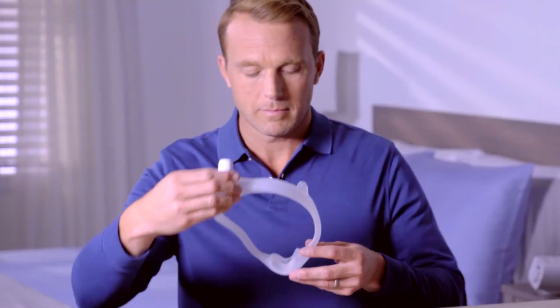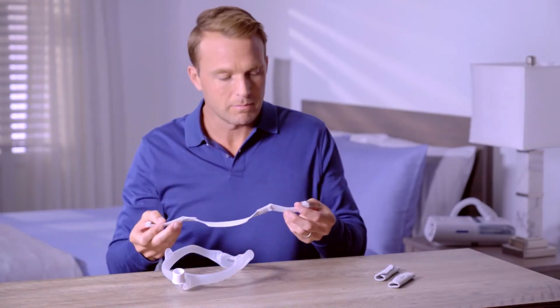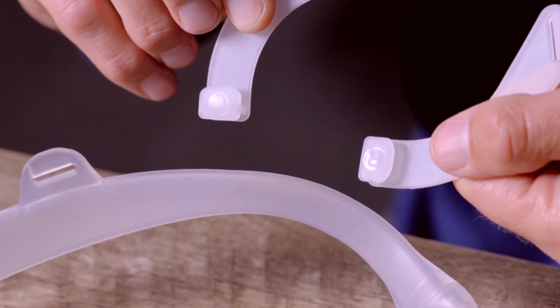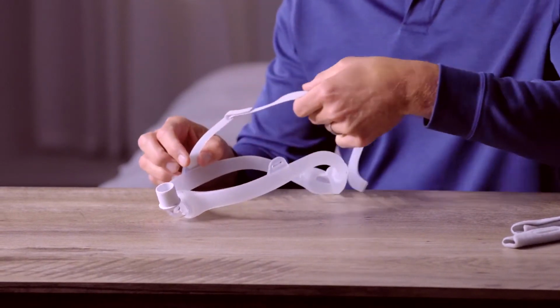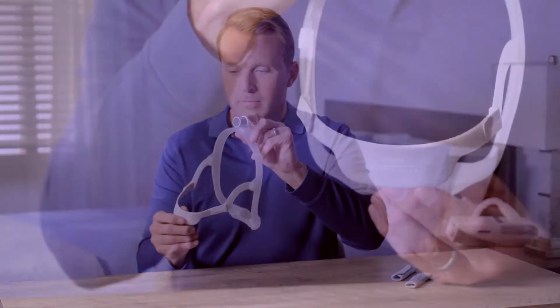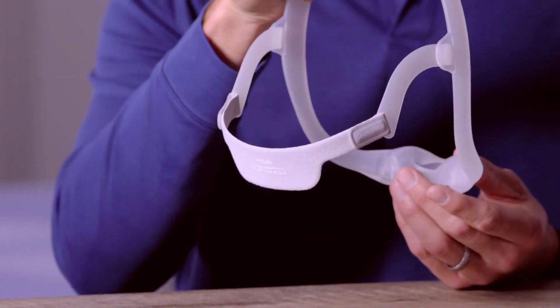To add the headgear, position the mask with the cushion facing forward. Look for the R and L symbols on the headgear arms. Push the R headgear clip through the mask frame loop on the right and the L clip on the left. When you're done, the R and L symbols should face outwards. The Philips Respironics logo should be on the outside and the DreamWear logo on the right.